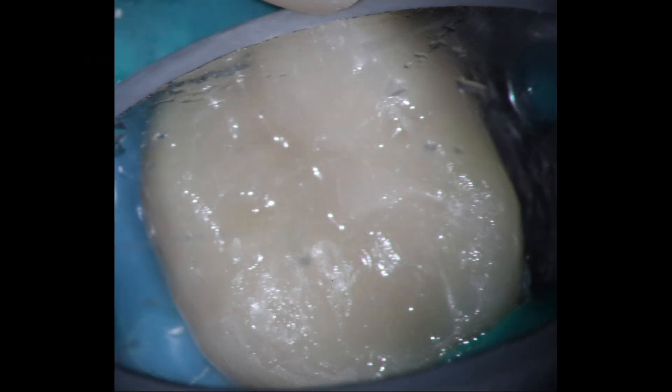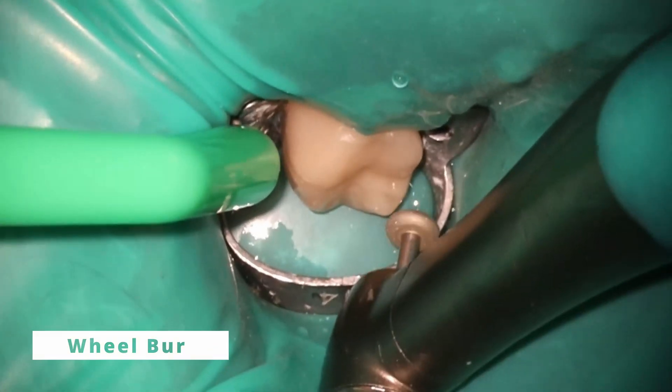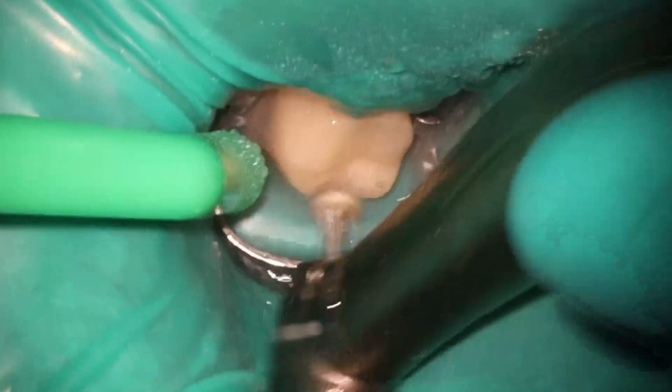As you can see from that case, a little bit of infection here. This is a guy who came in with severe swelling, a ton of pain, and because I had the GentleWave, it allowed me to finish this case in one visit and actually feel comfortable that it was going to be okay, which is super cool.